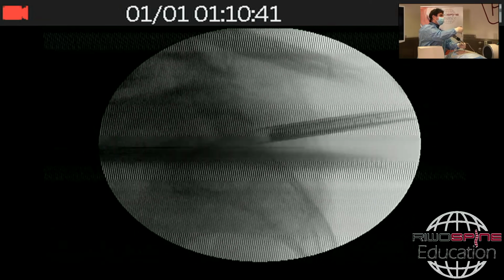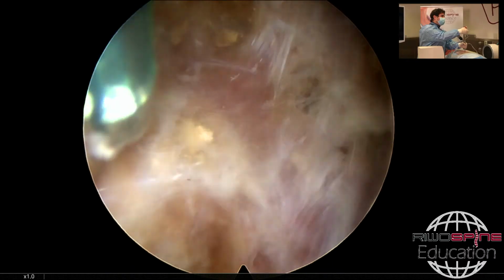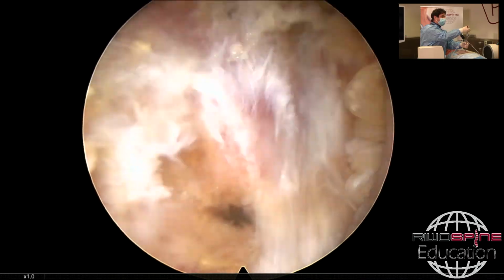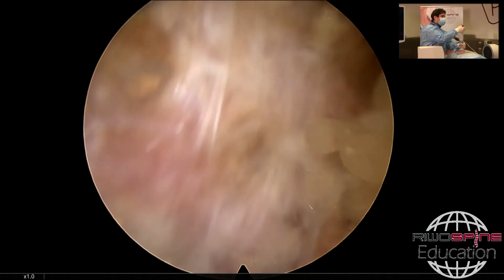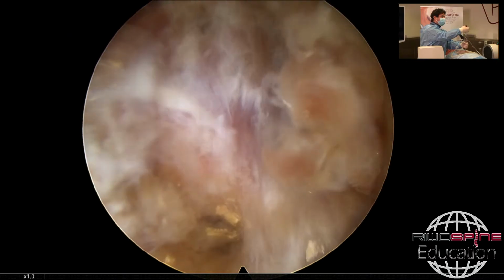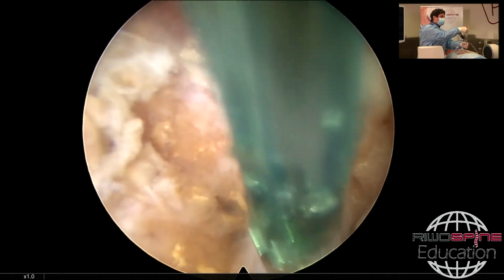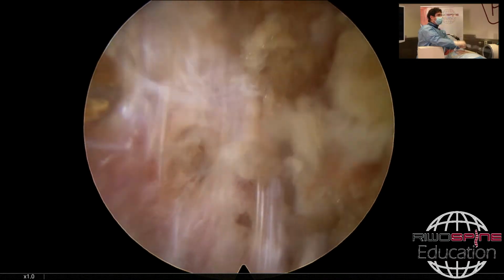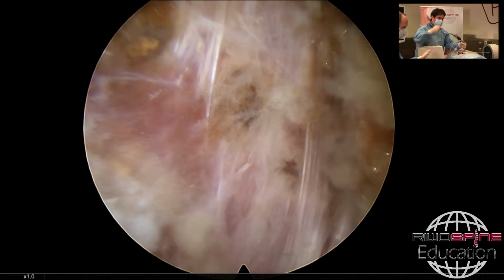Then what you can do, you can open the flavum ligament, or before that, you can drill the caudal lamina just a little bit to reach more. To do that, I would like to find the ascending and the descending facet junction first. And it's here that I can feel that. I'm on the bone, okay? Then I will do the opening with the flavum ligament.